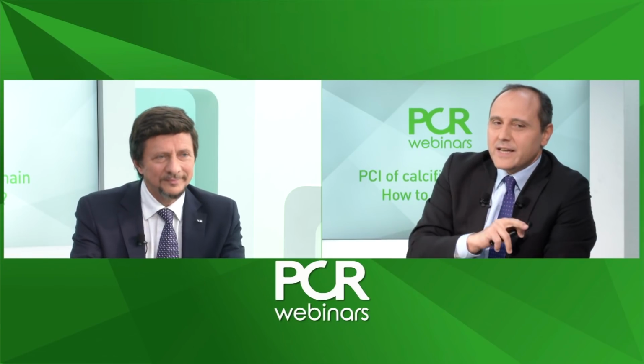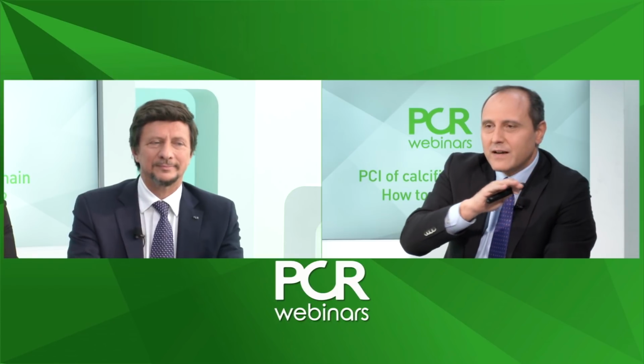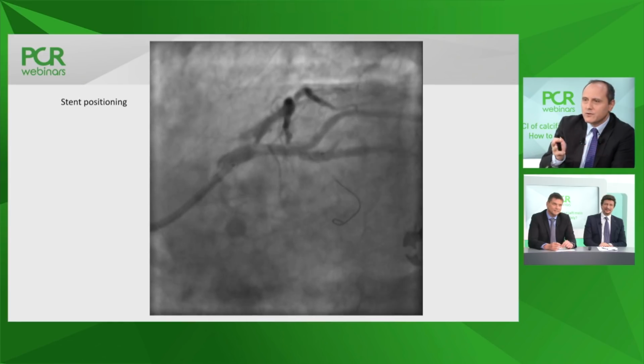Just a quick answer. In case your main vessel was the LAD instead of the circ, I'm sure here you might have thought, after all, I have a straight segment, and if I end up with a distal dissection there, I can have an easy life to advance an additional stent and fix the dissection. But if your landing zone, initial stenting, was towards the LAD, would you have chosen a different size?